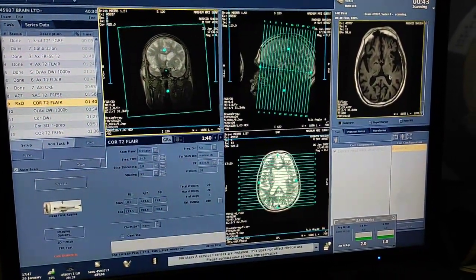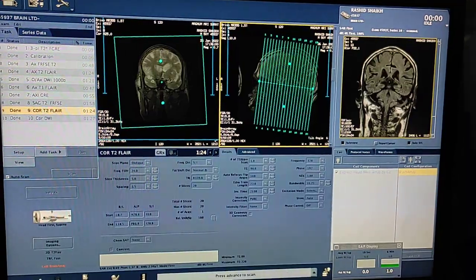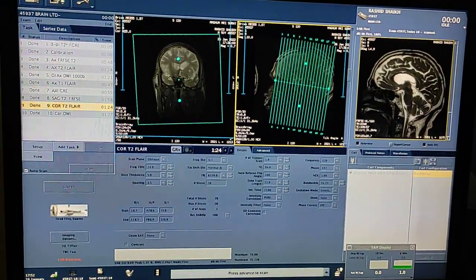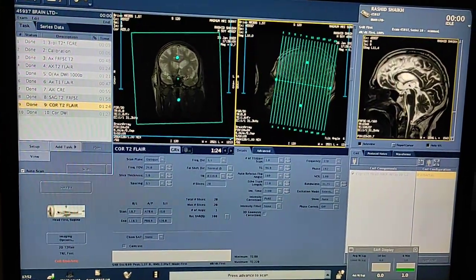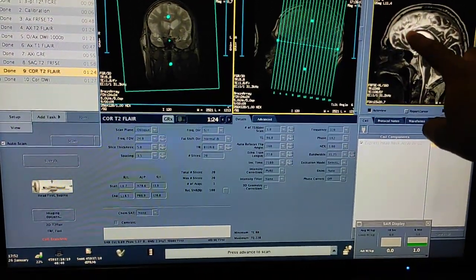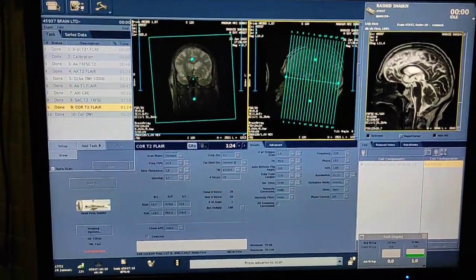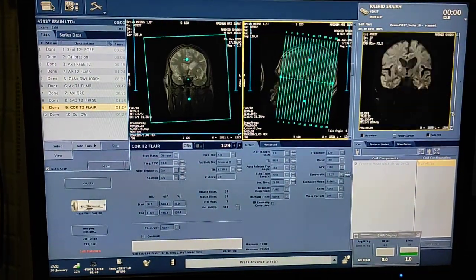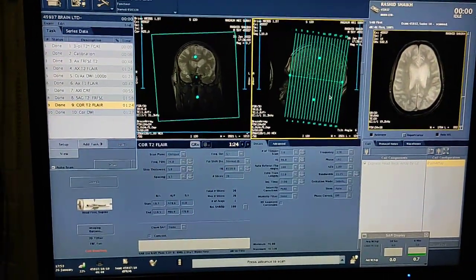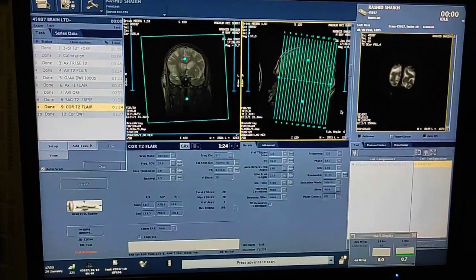This scan is done in brain coil with patient position head-first. I will show you when the images get displayed. This is how coronal FLAIR will look. The patient is altered, that's why he is not giving a proper position. The sagittal images will look like this — you can see the spinal cord, spine, and corpus callosum in one section. I have also taken coronal DWI for the medulla.